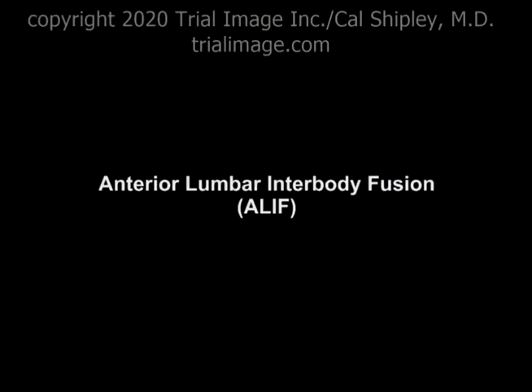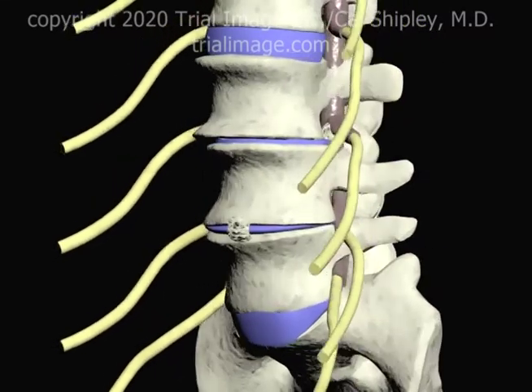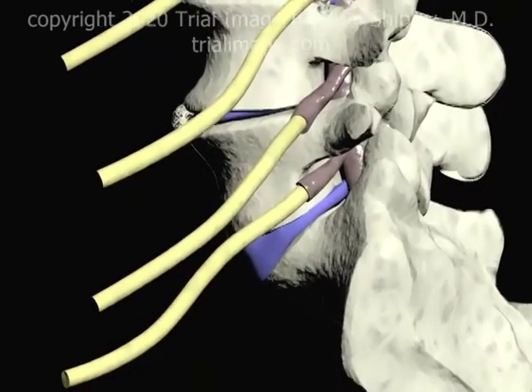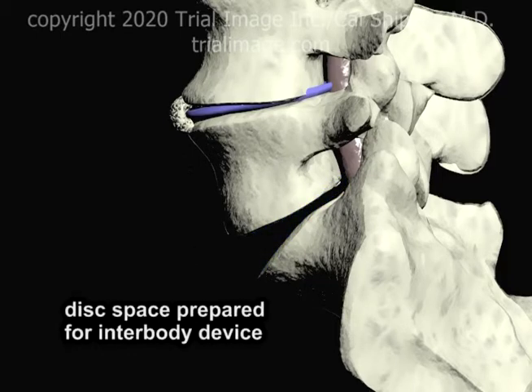Once the spine has been exposed by the retroperitoneal approach, as detailed in Part 2 of this series, the surgeon may proceed with the interbody fusion. The L5-S1 disc is removed, and the disc space is prepared for the interbody device.